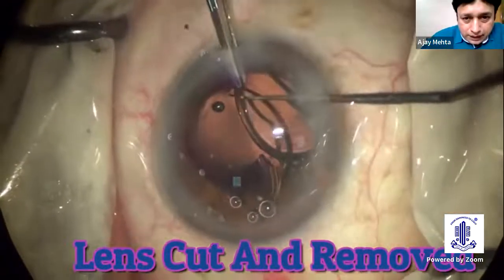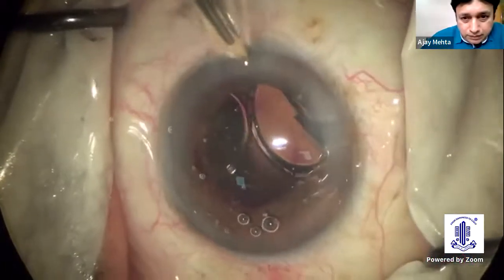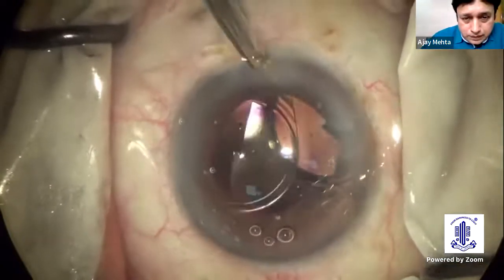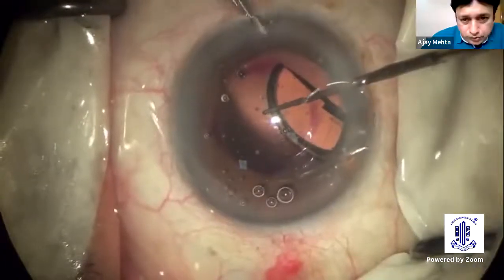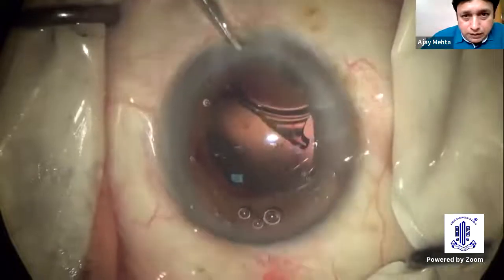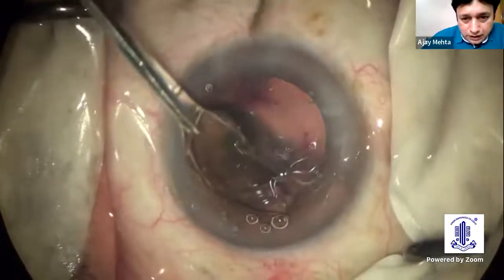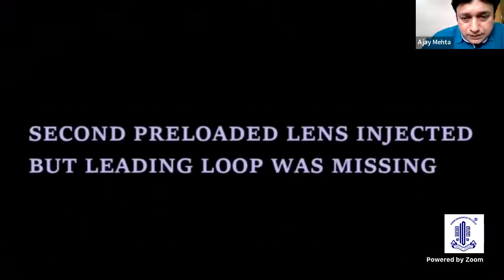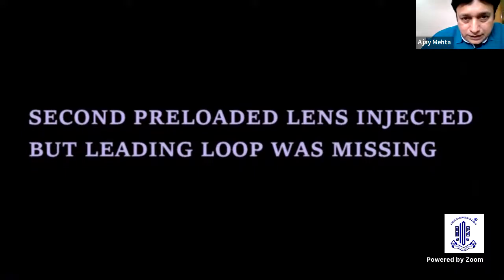And now I removed the IOL without enlarging the wound at all. Now I was wondering what to do. We had a replacement lens available, so I asked my staff to open a new preloaded lens, and then I did the injection of the lens.